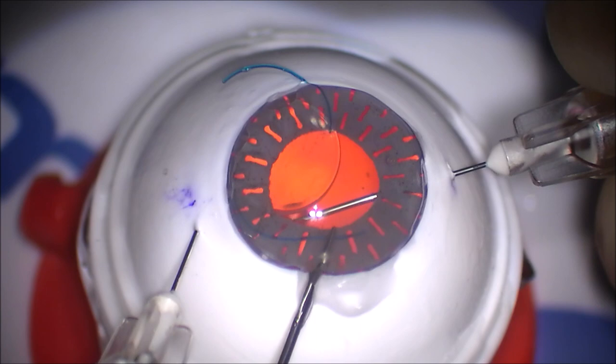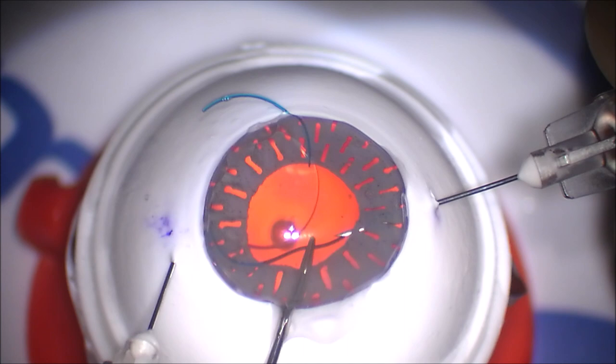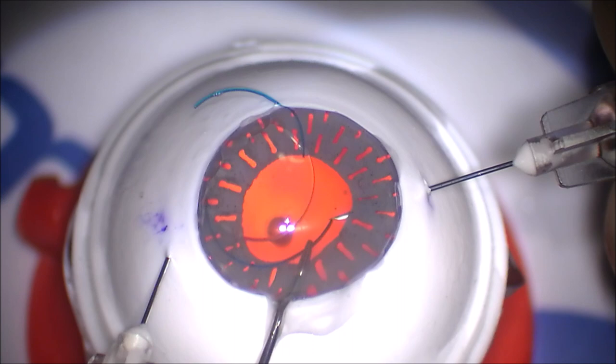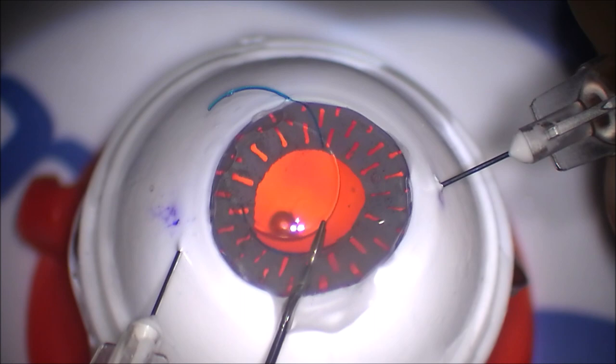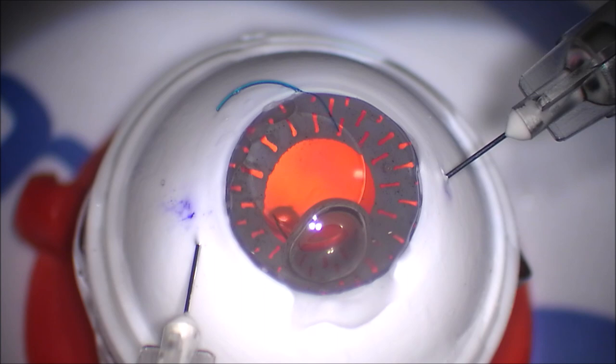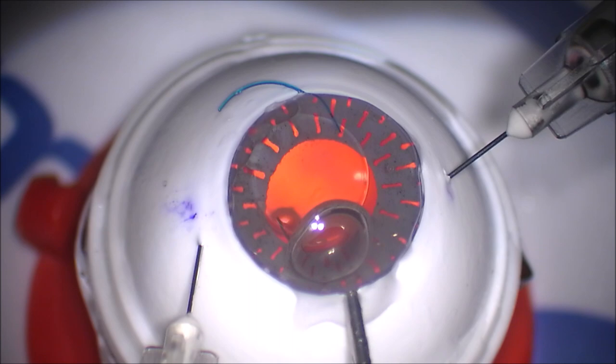And then if the diameter is different, you'd have to shimmy the instrument over for the left side, aligning it with the limbus on the left side, and then passing the needle. And so again, it's not that big of a deal, but that would be the only way to make sure that you're two and a half millimeters posterior to the limbus when you're doing the needle pass. You don't want to be too anterior and hit the ciliary body. You don't want to be too posterior and hit the retina.